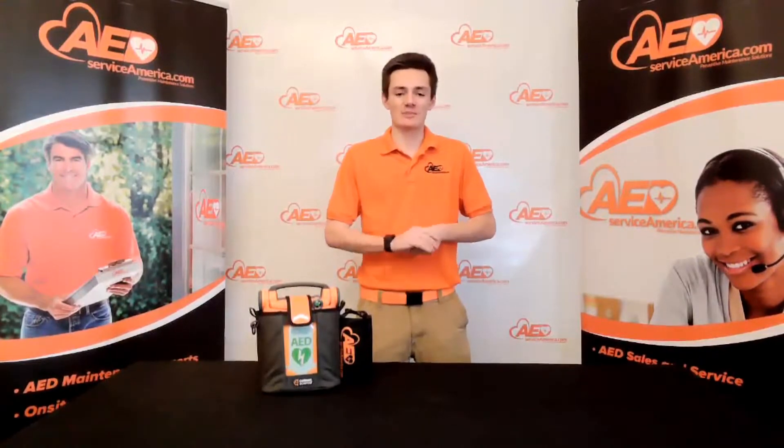Hello, everyone. Nathan Marin from AED Service America. I hope you're all doing well. Today, we're going to talk about how to replace the primary adult pads as well as the battery in your Cardiac Science G5 AED. The process is relatively simple, so we're going to jump right into it.